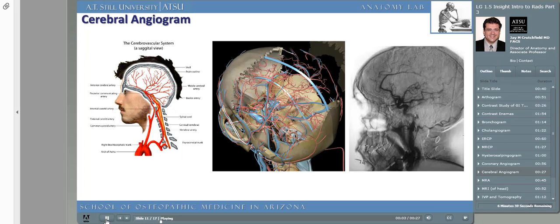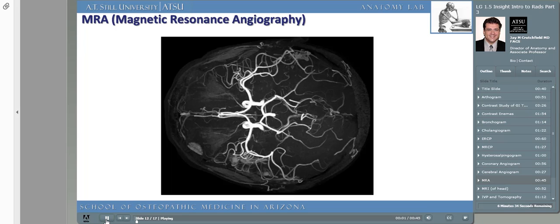Just like coronary angiograms, we can also obtain images under fluoroscopy of the vasculature of the brain — called a cerebral angiogram. Review the anatomy in the image on the left and see if you can locate those vessels in the radiograph on the right. The middle image is taken from Cyber Anatomy, a program you'll have access to via the Learning Resources Center through AT Still Memorial Library. Just as with classical coronary angiography, we can also use an MR scanner to obtain images of blood vessels — a magnetic resonance angiogram, or MRA.